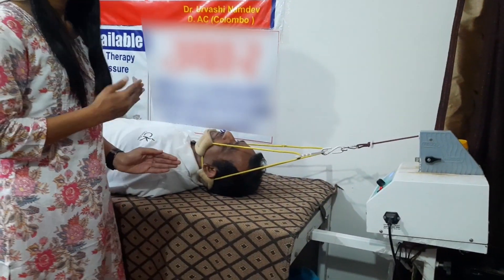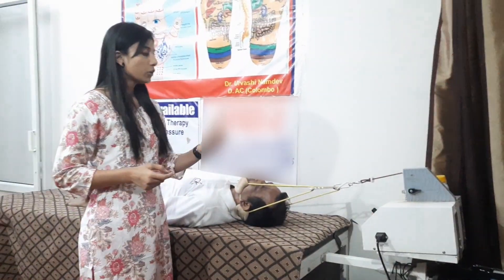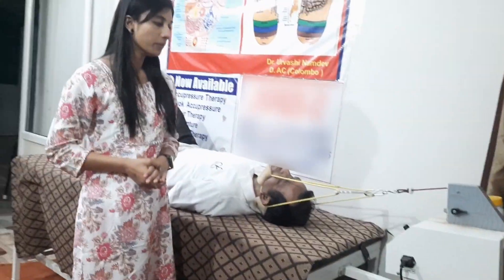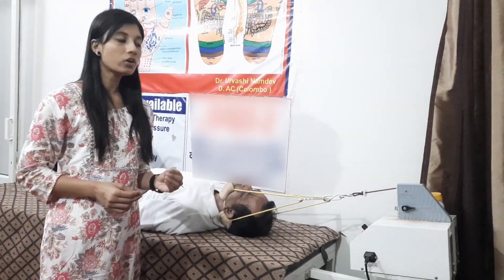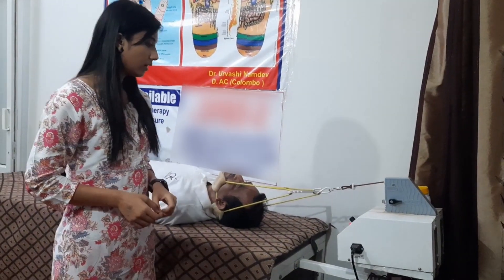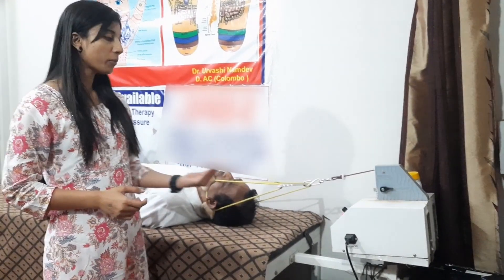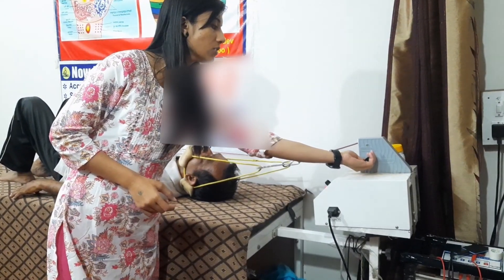The patient will feel a pulling effect — the traction will pull longitudinally. It will pull for 20 seconds and then release for 5 seconds. After release, the patient should rest for 1 to 2 minutes. The machine will automatically release. This is about the traction machine — thank you.